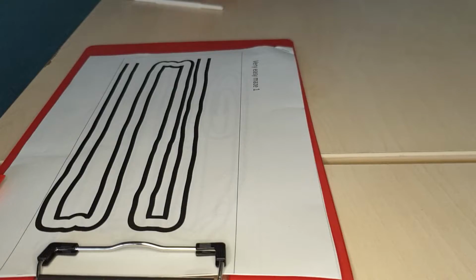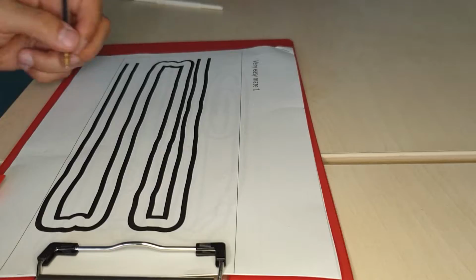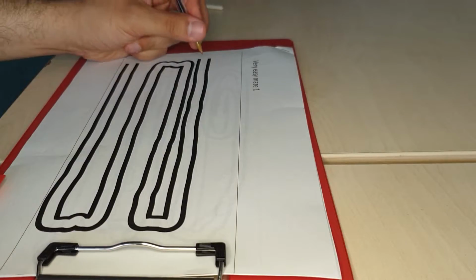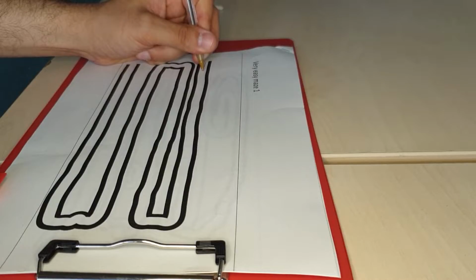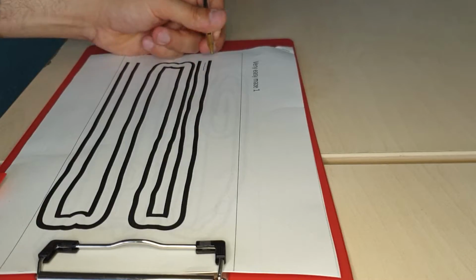Originally, we had looked at just getting students to use a pen and follow a maze. As you can see, this is a pen, and this is how you'd normally hold a pen. The issue with this is that a pen is not a contra-angled instrument. And so, although we can use a similar grip for a handpiece, it doesn't give us the exact same feel.